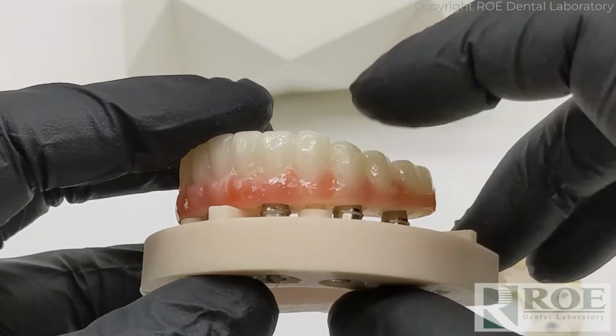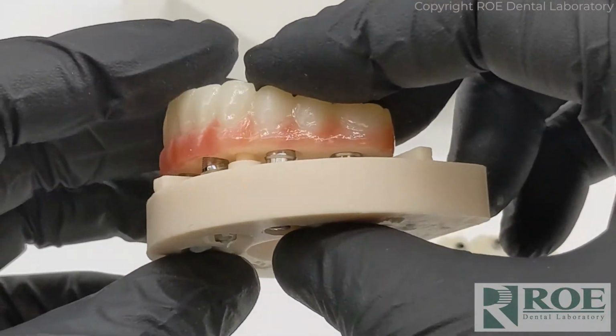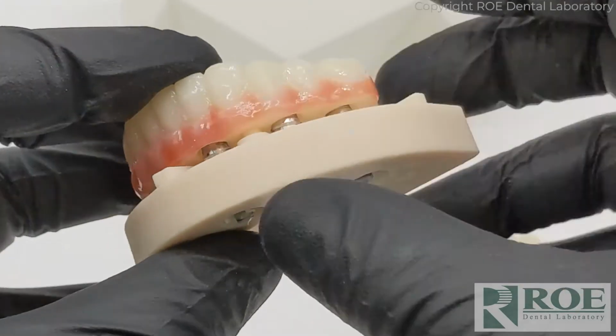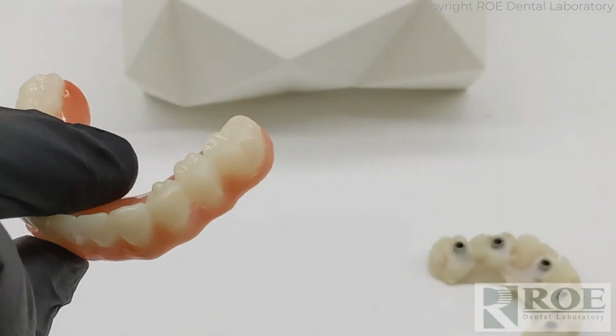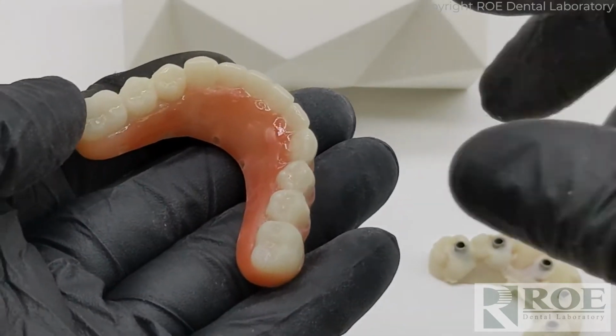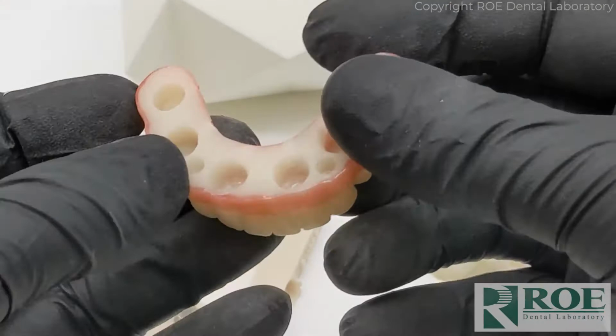So I'm going to go open this one up, and I'm just kind of looking around. It looks like all the rest of them are going to be just fine. So I'm going to open this one up, and I'm going to drill some lingual ports, and then we'll finish the conversion. The adjustments are made. I drilled the lingual ports, just one on each site.